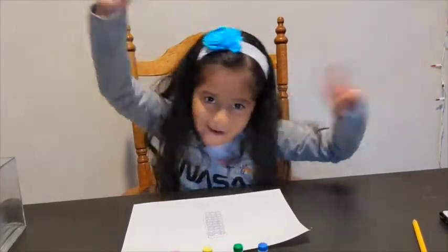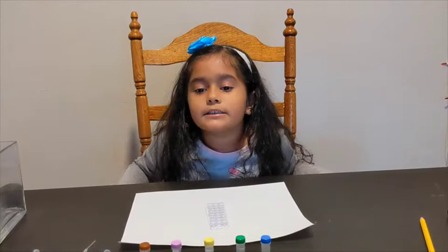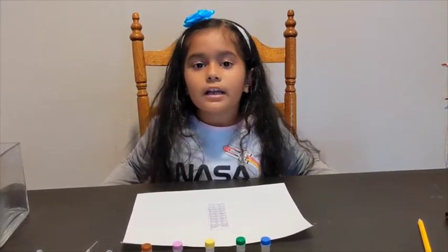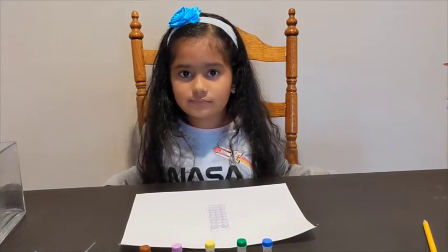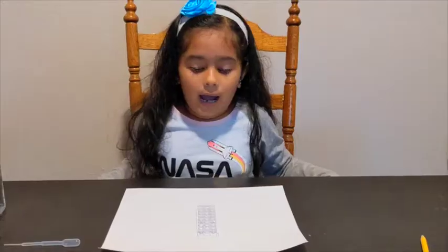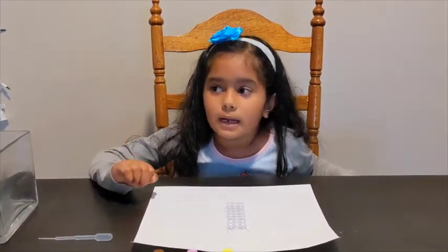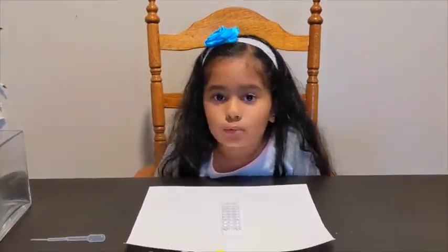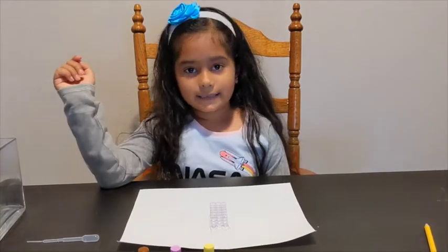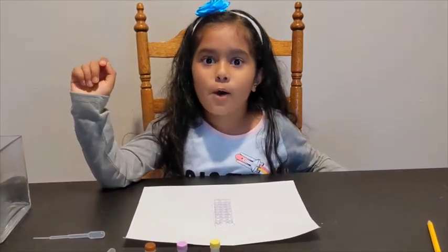Next I will add two drops of positive control sample into two positive control wells. I am now going to add two drops of sample one into my sample one wells. Remember, I predicted sample one had the coronavirus.